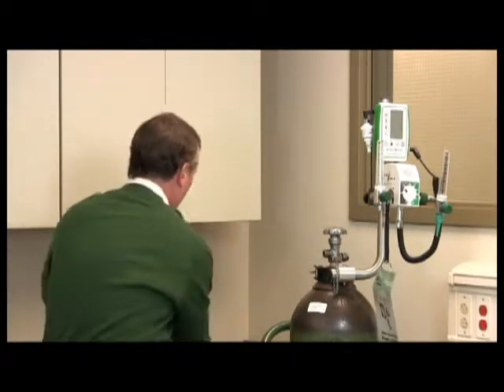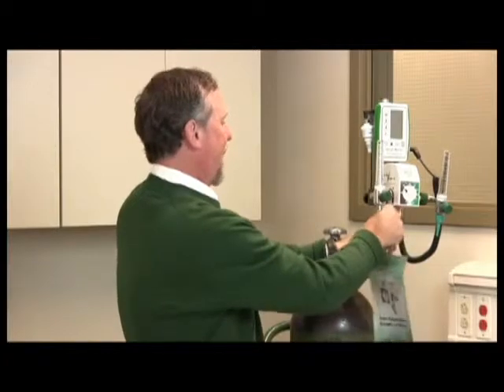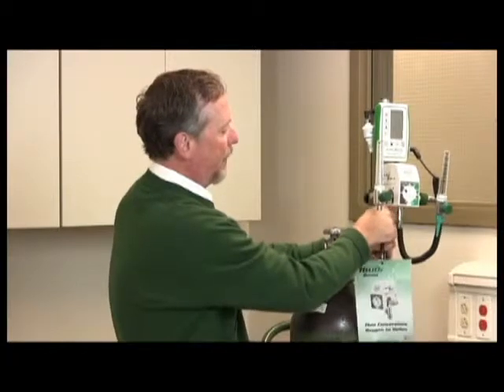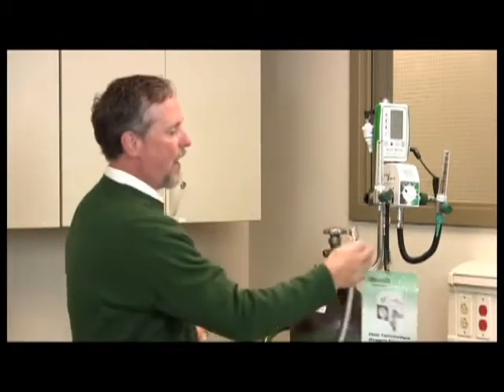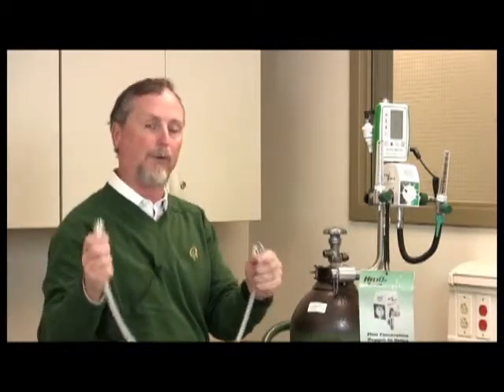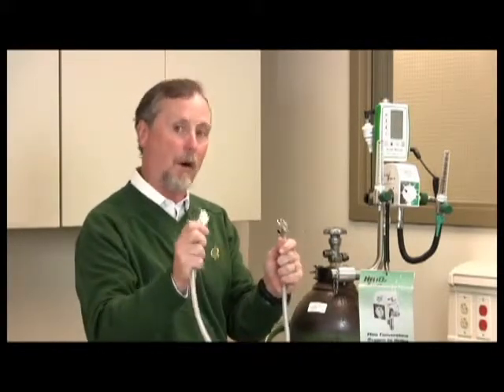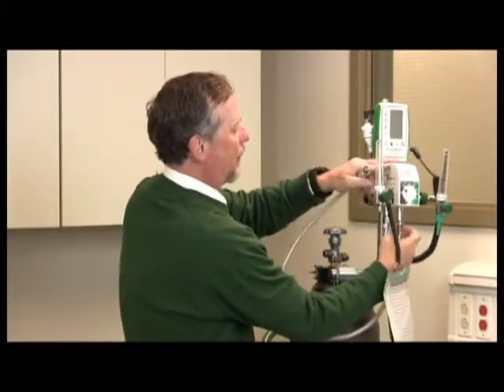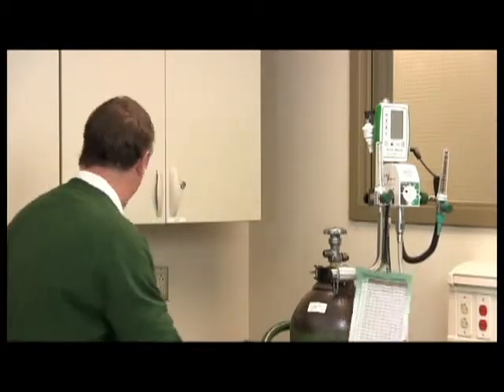So from there, we can install our high pressure hoses. We have our oxygen hose, and this is a male into a female connection. Our inlets for the blender are on the bottom of the blender. So this will then get installed to the wall. And then from here, this is our Heliox connection. And again, this is our Heliox hose. It's a white braided or clear braided hose with white in it. Both of these connections on here are Heliox connections. This inlet is not an air connection. It's an actual Heliox connection. So we can install these hoses, one to where normally the air fitting would go, but in turn, this is the Heliox fitting. And then this will go on to our regulator.